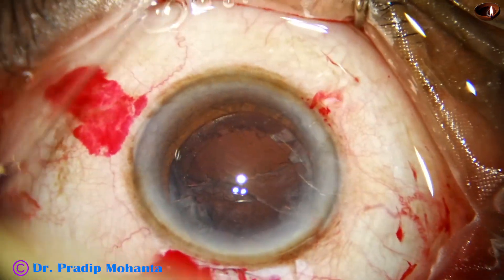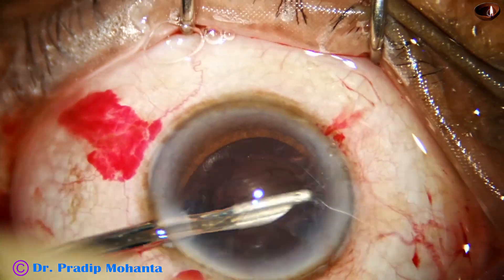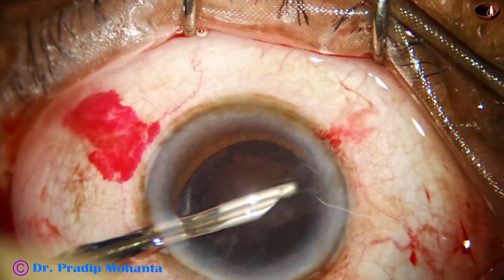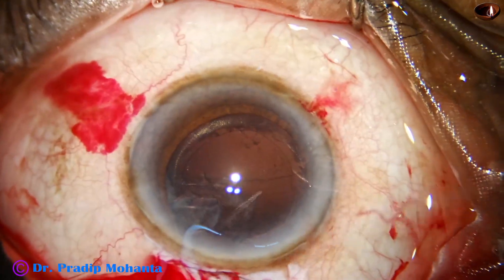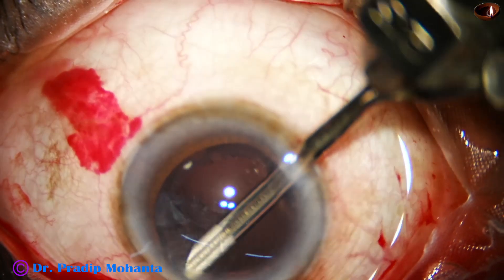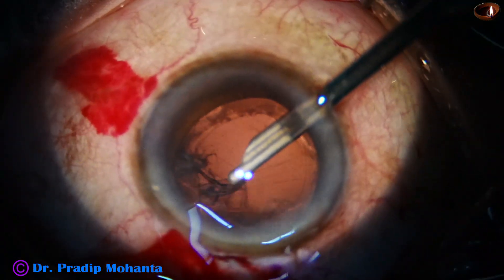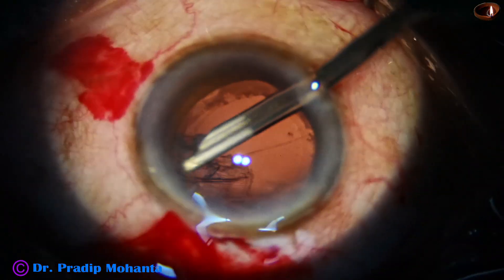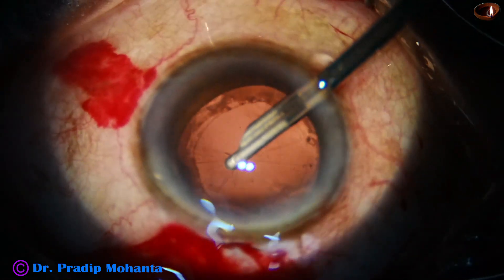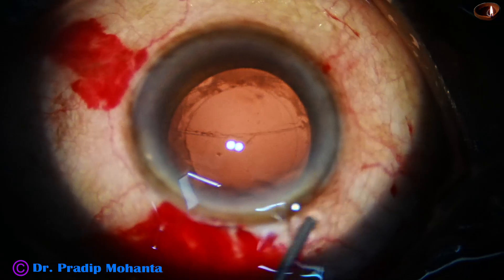Some viscoelastic — this is Viscoat, a combination of chondroitin sulphate and sodium hyaluronate — is injected. Now I go through the eight o'clock sideport and remove the rest of the cortex from 12 o'clock to two o'clock. All the cortex is nicely removed.